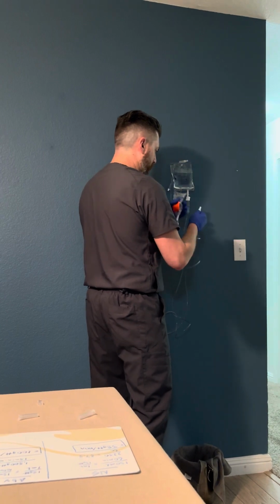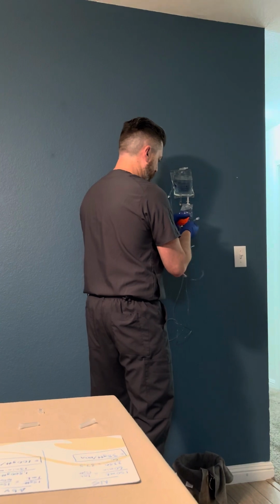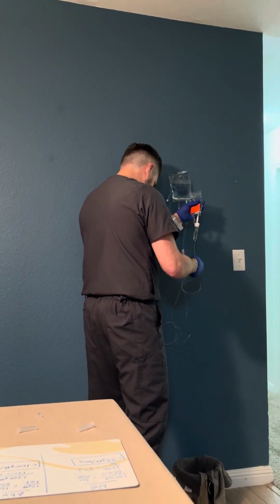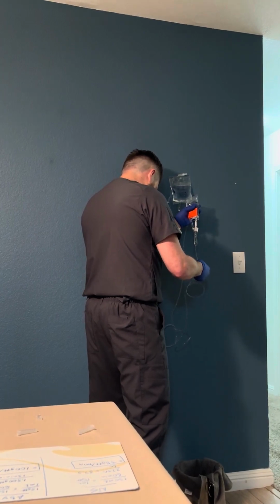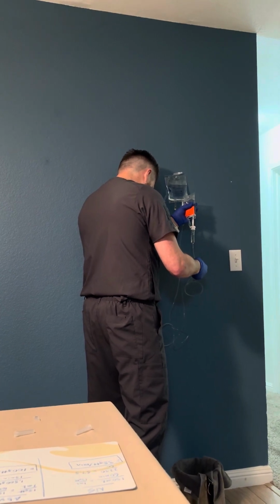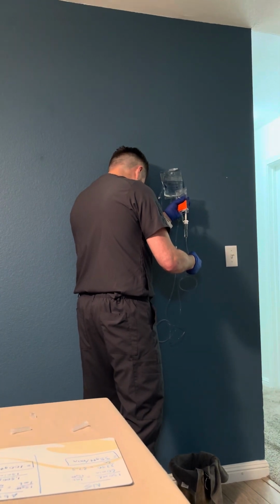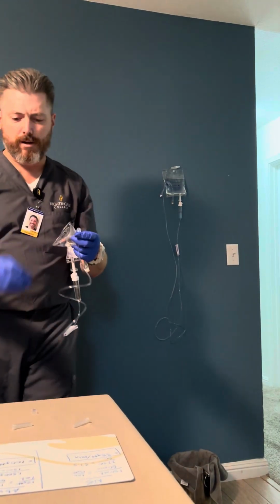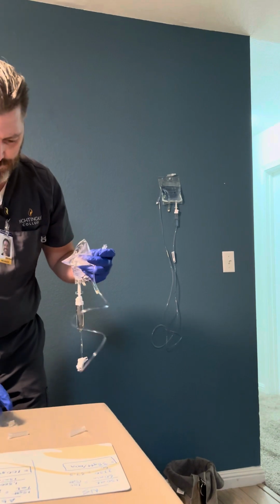I'm going to remove the cap here. Alright, clamp it, put the cap back on. Where'd my cap go?